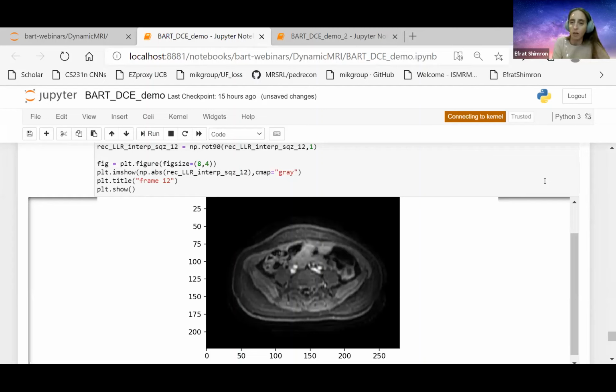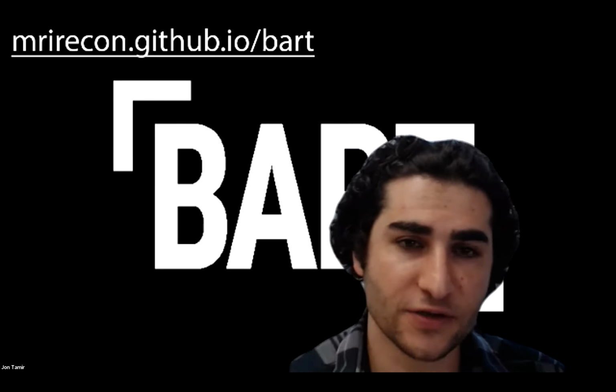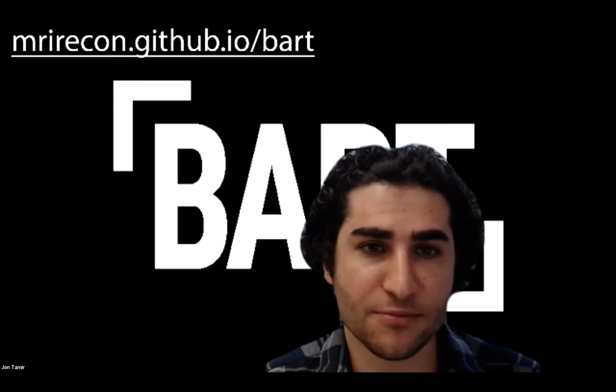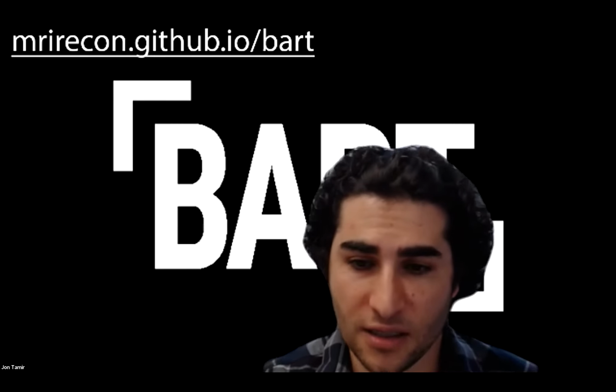Yeah, thank you, Efrat. Back to you. Yeah, thanks very much, Efrat. A lot of really helpful information there. And a lot of these techniques also extend to data that has multiple extra dimensions. So it could be respiratory motion and cardiac motion and contrast and relaxation. And so this interface is really helpful for processing these highly multi-dimensional data sets.